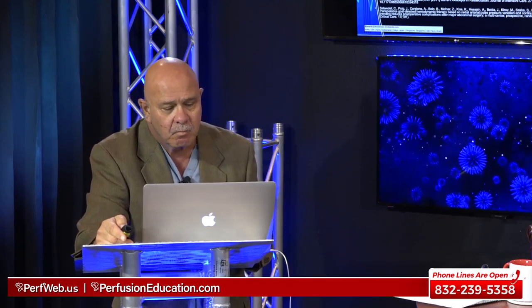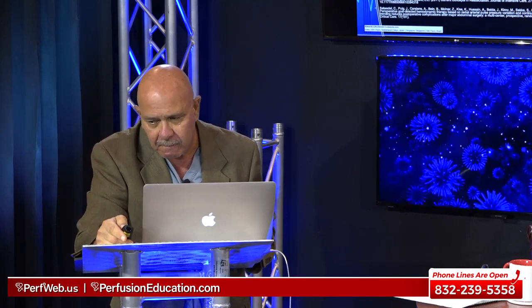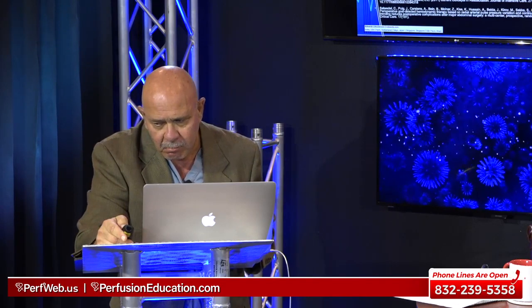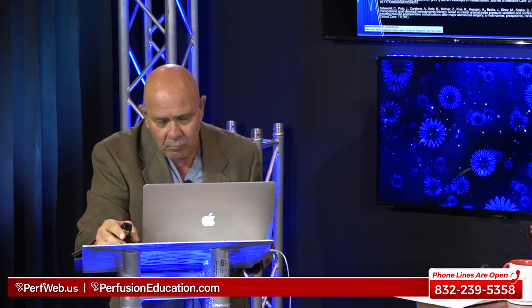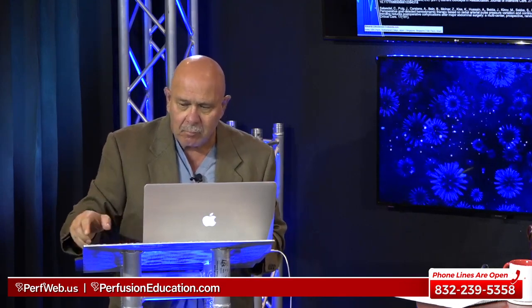Thank you. Just my second question. If I don't have anything that helps me measure the patient's cardiac output, how could I know that my patient already has a hyperdynamic situation, and I should start to give him a beta blocker or something to reduce his cardiac output to maintain the flow ratio between the ECMO and cardiac output?